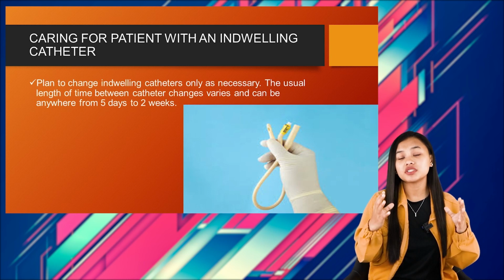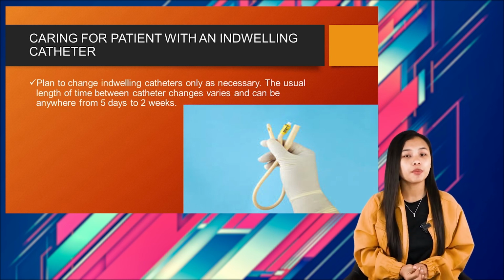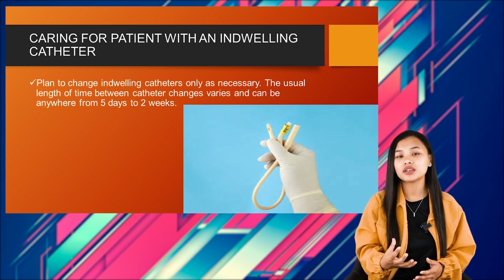So these are the various points that you need to keep in mind when you are providing care to a patient, especially one who is under an indwelling catheter. So now we have come to the end of this topic, whereby in today's session we have discussed in detail the various steps we need to follow when we are inserting the catheter, as well as the points that we must keep in mind whenever we are providing care to a patient under an indwelling catheter. So I hope you have got a clear understanding of this topic.